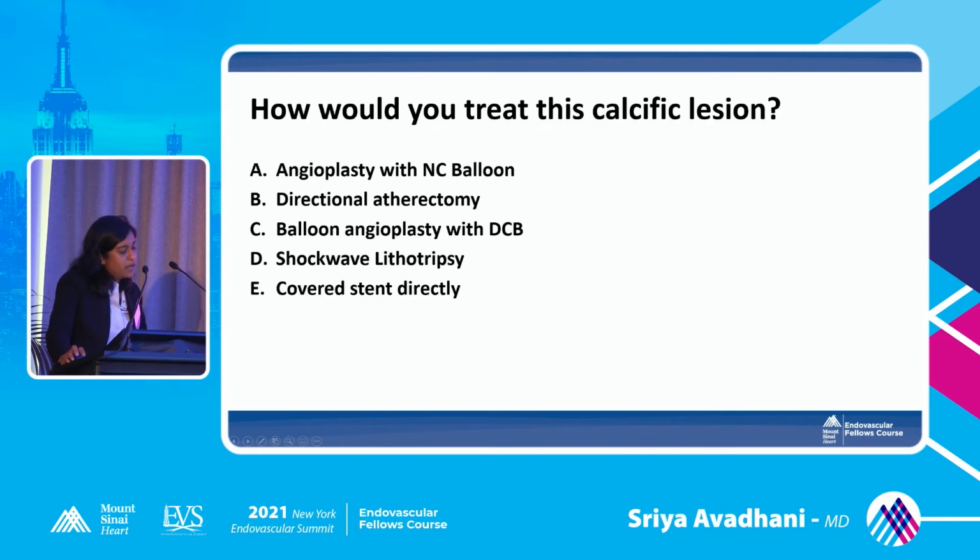So at this point, I have a question for you guys. How would you treat it? Would you use an atherectomy to modify the calcium? Would you use atherectomy, just angioplasty with an NC balloon, DCB, shockwave, or covered stent directly? Any thoughts?